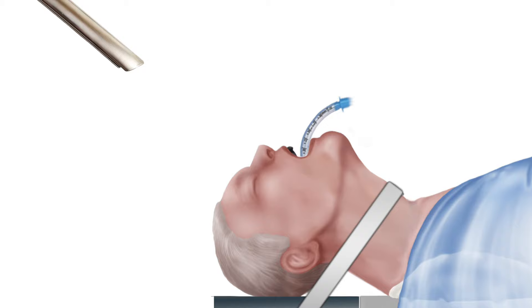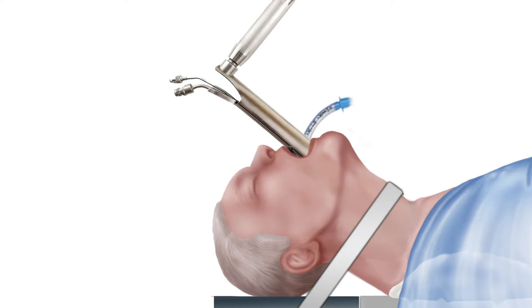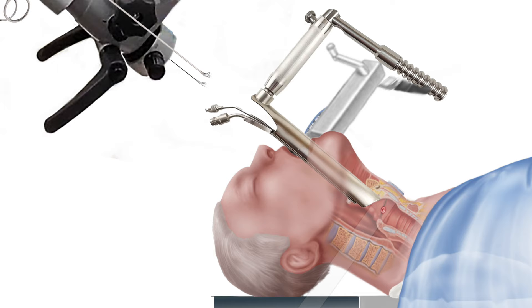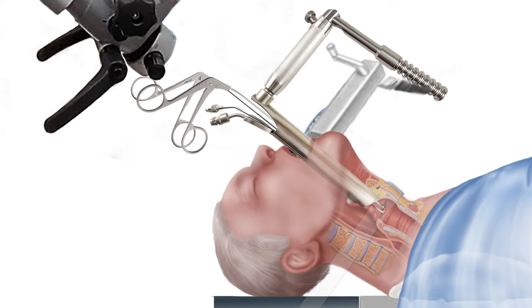A special instrument called a direct laryngoscope is then used to visualize the vocal cord mass and placed in suspension. Because the mass is so small, a microscope is used by the surgeon to obtain a magnified view of the vocal cord mass. Through this instrument, a triangle forcep is inserted down to where the mass is located and grasped.